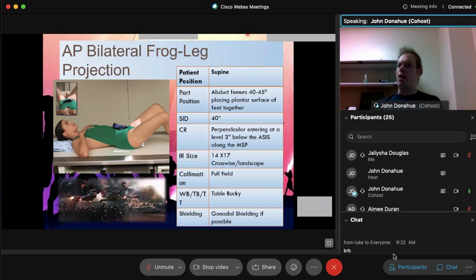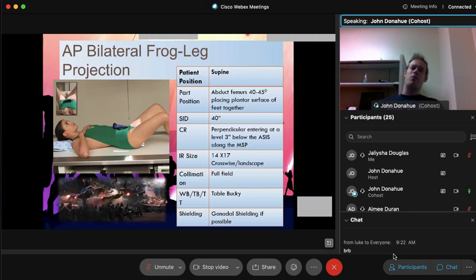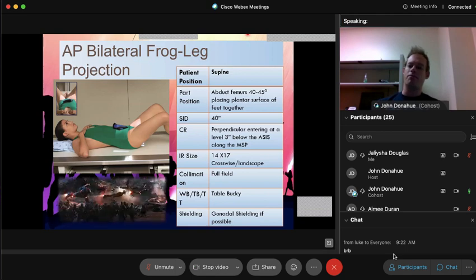And I don't know if you guys learned in lab, but a great way to find that MSP, you always ask that patient to point to the tip of their sternum, xiphoid process. Don't call it xiphoid process. Patients don't think you're speaking another language. They don't know what that is. Ask them to point to the bottom of their breastbone or sternum, and that will be your MSP. And line that crosshair up with that and get a nice central exam.